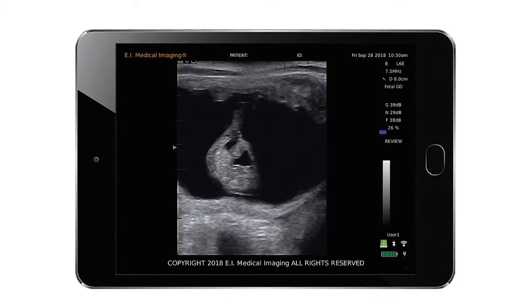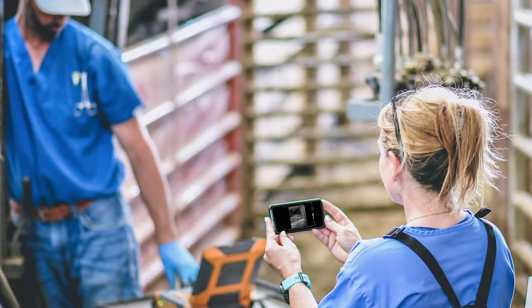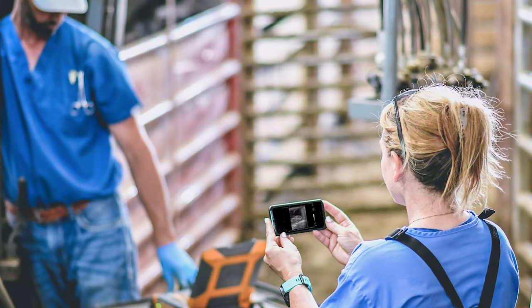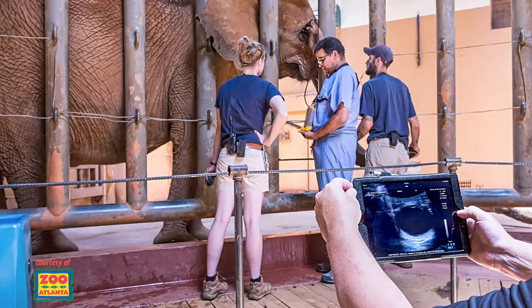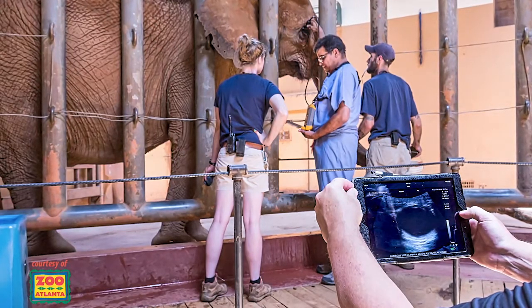We pioneered the first ultrasound app, EvoStream, which sends a wireless image to up to four mobile devices and allows the rest of your team to view the exam from a safe distance as you scan. This feature is ideal for teaching, as well as in scenarios such as zoos, where only the necessary staff are in contact with the patient.